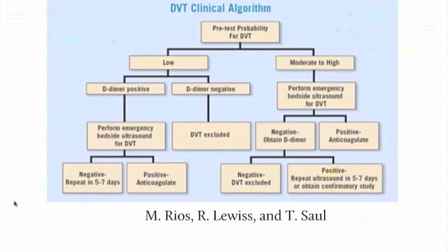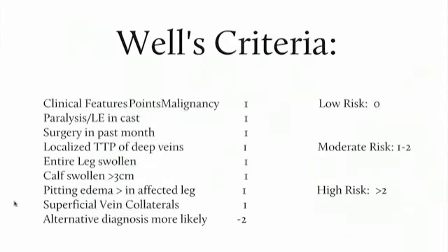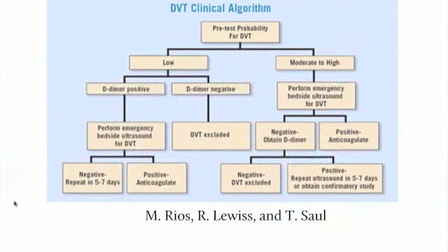This is an inherent problem that we have in emergency medicine in multiple different areas right now, because we've got these clinical decision rules that clearly the evidence is very good for. Like the one that we're looking at right here. Wells criteria is a clinical decision rule that we really can't refute. And we don't have those kind of rules for ultrasound, but we, as emergency physicians, know that ultrasound is extremely sensitive in these cases. So it's pretty challenging trying to mix this evidence-based medicine that we have in front of us to make the right decision.